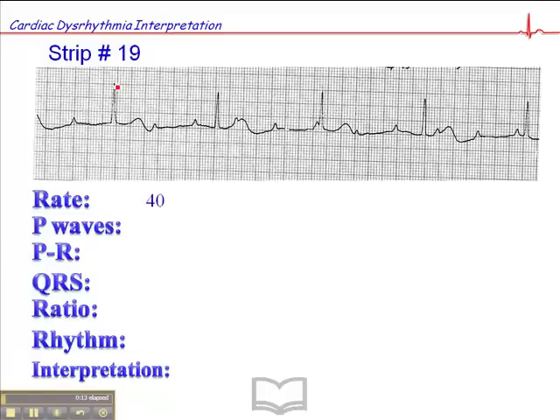If we map it out, here's one that falls just to the left of a dark line. The heart rate here is 300, 150, 100, 75, 60, 50, 43, and 37. So between 43 and 37, keeping in mind that this one's on the other side of the dark line, so that's about 40. I think that's fair.